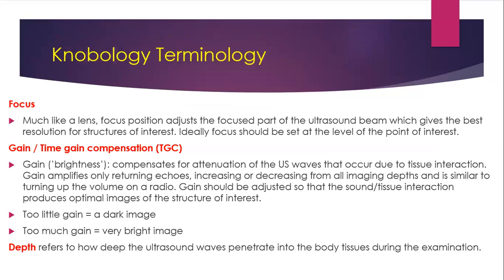Okay, so the knobology terminology is that there is a focus, much like a lens, and that is the focus part of the ultrasound beam, which gives the best resolution for the structure of interest. Ideal focus should be set at the level of the point of interest. So focus is much more or like the cursor.